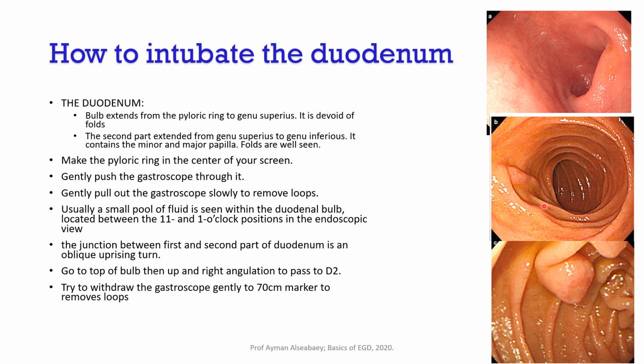make full flexion of your left elbow, and make the head of the endoscope parallel to the right axilla with gradual up, and the endoscope follows, this is the same, okay? Sometimes when you go to the second part and you try to push the endoscope to go deeper, you will not have this movement. This means that there is a loop in the stomach. Here you do clockwise rotation and pull the endoscope out. On the screen, you will find that they are going deeper. Okay, this correlates with the presence of a loop.